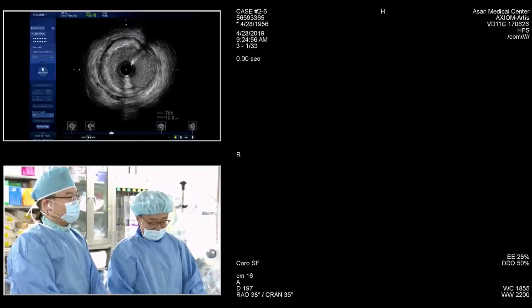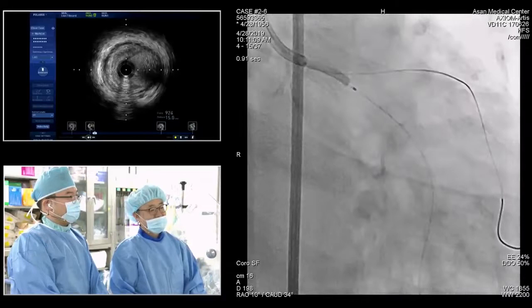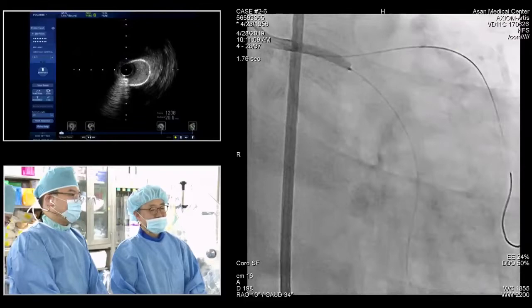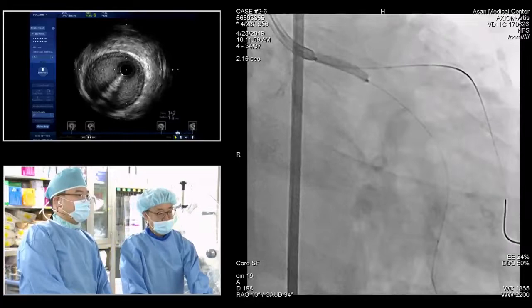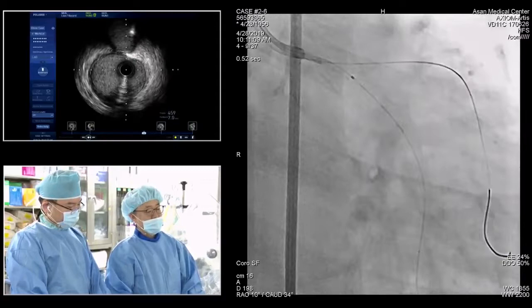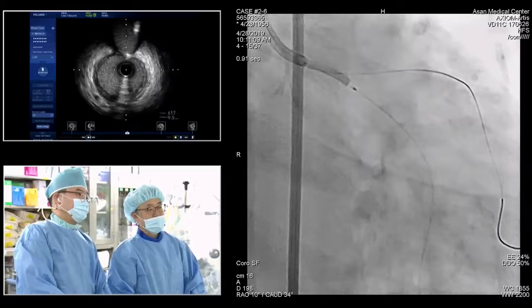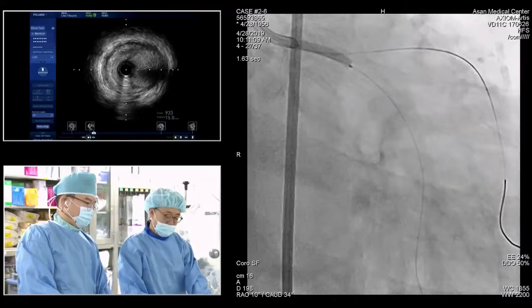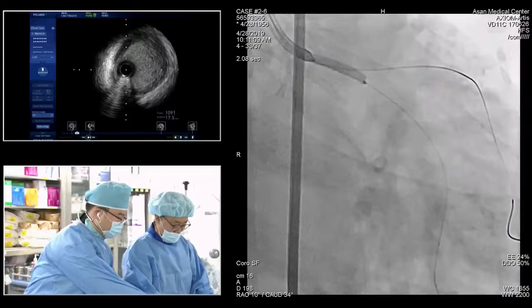Okay, next one. In these cases, I prefer the culotte. The reason is that the jailing of the LAD risk is low. First of all, the axis from the left main to LAD is quite straight, not angular, so it's quite easy. Second, the left main LAD ostium area is quite large, so even if the LAD is jailed, we can easily wire. So just cross the stent and do balloon dilation, and look at the status of the LAD. If there is a significant narrowing at the LAD, you can do the culotte, or if the lesion is quite well, just leave it. That would be the advantage, and it's not too late to change, because you can always convert one stent into a culotte.